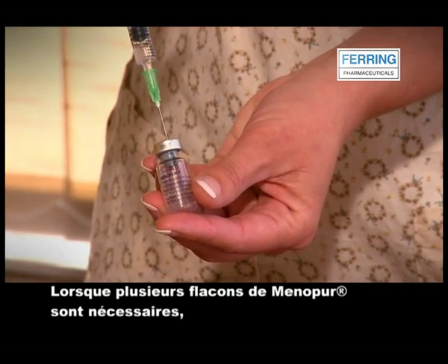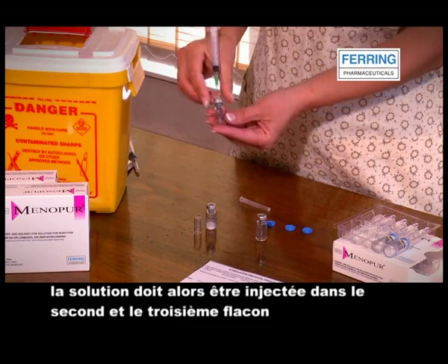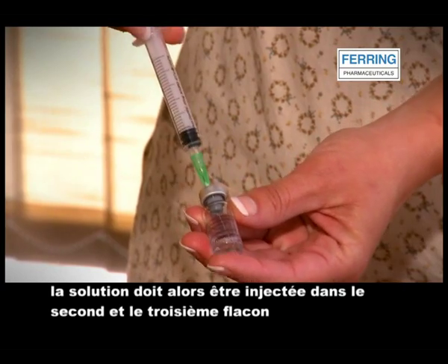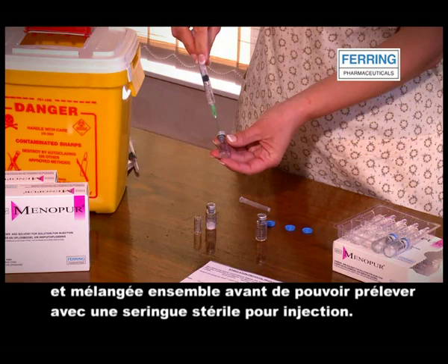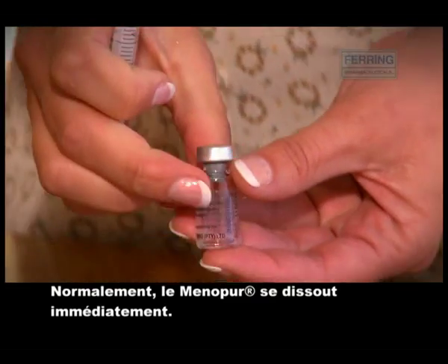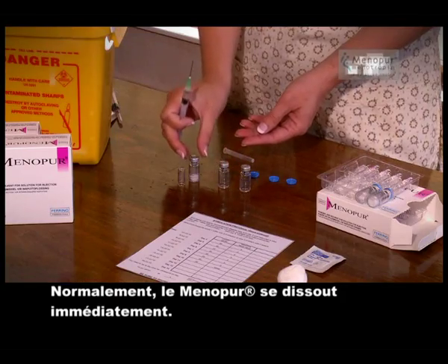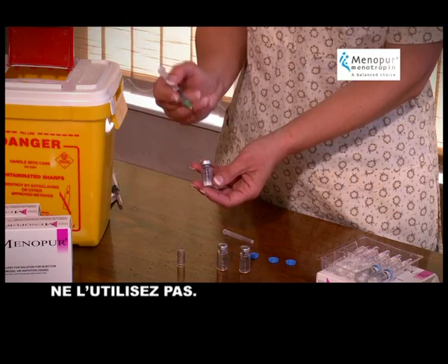If more than 1 vial of Menopur is required, then the solution should be injected into the second and third vials and mixed together before being drawn up into a sterile syringe for injection. Generally, the Menopur dissolves immediately. If it is not clear or has particles in it, do not use it.